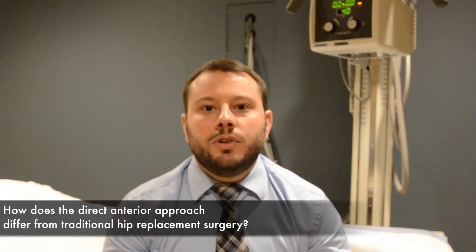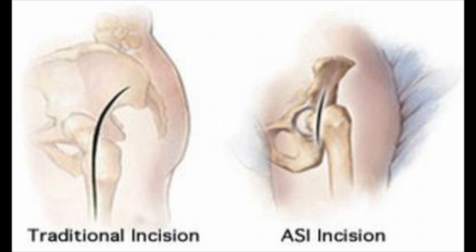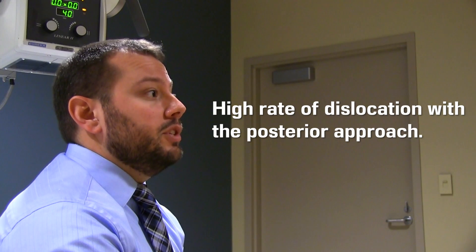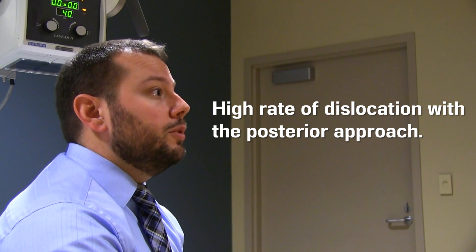In traditional hip replacement surgery, the surgeon would make an incision on the side of the hip and access the hip joint from the back, or posterior aspect of the hip joint. In order to do this, he had to cut through tendon and muscle to get to the hip joint. Although this is the gold standard of hip replacement surgery, there is a relatively high rate of dislocation with the posterior approach, reported between two to four percent.